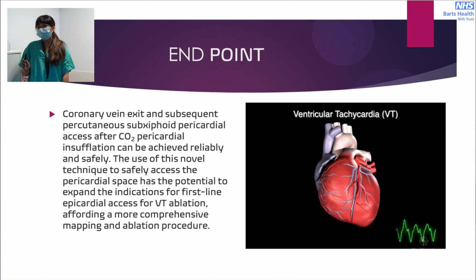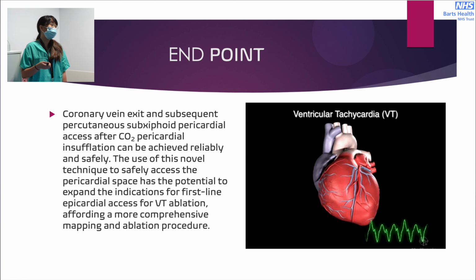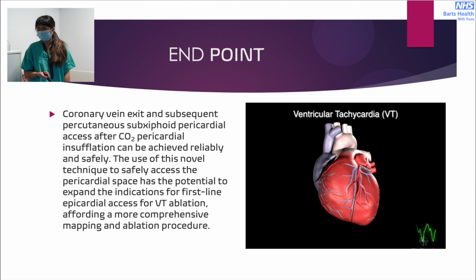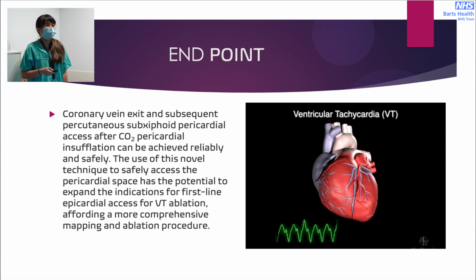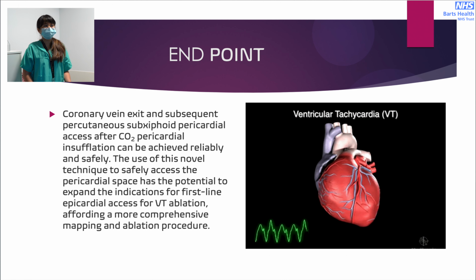So for the moment, we don't do this routinely for epicardial access, but Dr. Chow said they do it routinely in Brighton now. So if this can be used as often now, then we can do this routinely, and it can be the first line method for epicardial VT ablation.